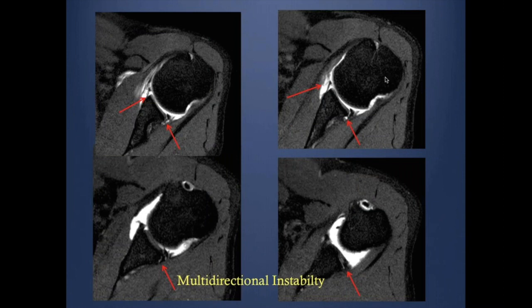In multidirectional instability, an arthrogram shows tears in both the anterior and posterior labrum, which is a typical example of multidirectional instability.